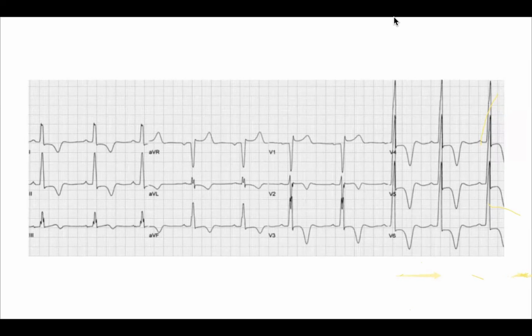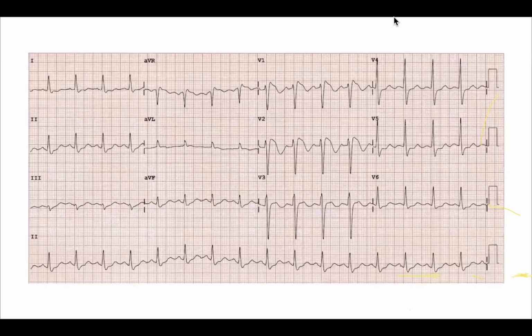So just have this pattern in your mind, and you should be able to differentiate this from LV strain. Today itself after this lecture, type LV strain and see the difference. Again, what is this? This also has been given in your exams, because identifying these things saves lives, like MI.